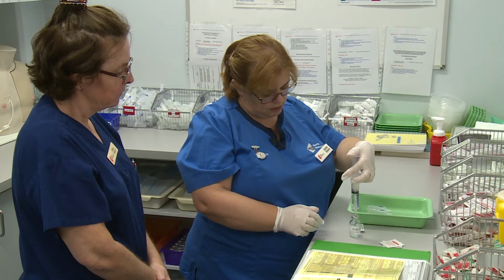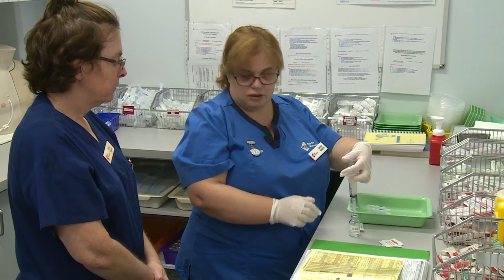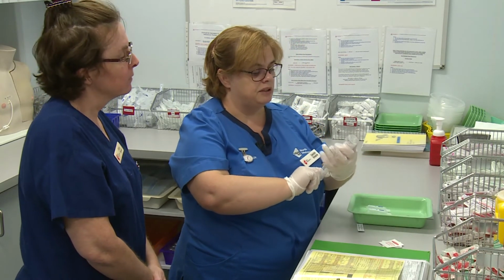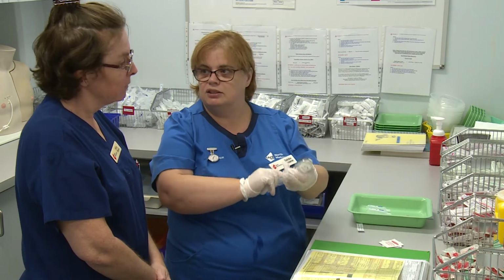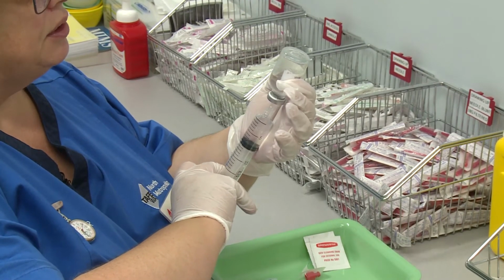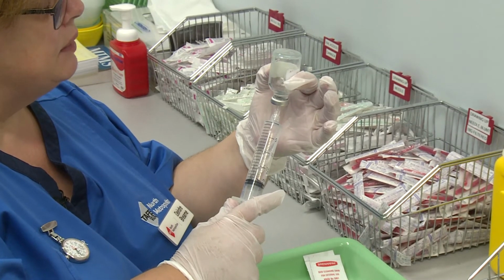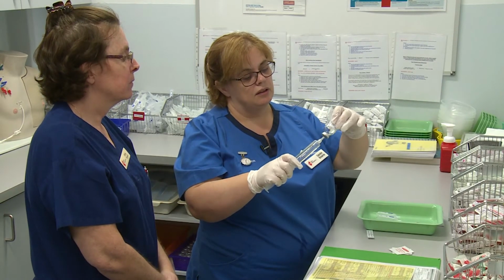And the aim is we're going to reconstitute this powder and it'll be in liquid, this medication will be in liquid format so that we can actually inject it. So you will notice there's a little bit of pressure, and you're going to gently agitate this to make sure that this medication is fully mixed. And then I'm going to use the positive pressure to draw it back once it's finally dissolved. Sometimes it takes longer than others to dissolve.